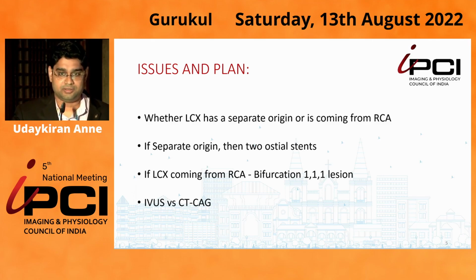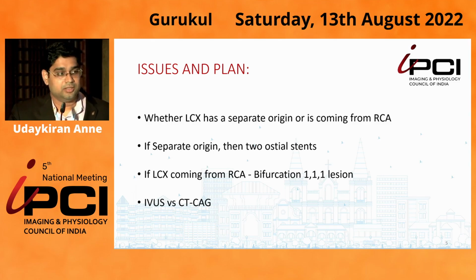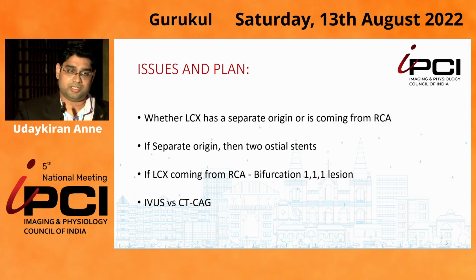So how do we evaluate? We could go ahead with either intravascular imaging or plan a CT coronary angiogram prior. In this case, we specifically wanted to do a CT coronary angiogram for the following reasons. We wanted to define the LMCA ostium, again because she is a relatively young lady. Takayasu's or any middle aortic syndrome, where even the aortic branches are normal, but only the descending aorta and the abdominal aorta and the coronaries are involved, are cases we see not so infrequently.